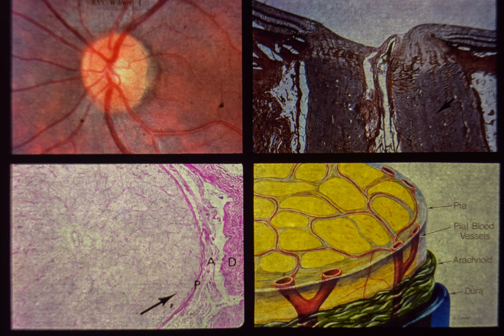The normal peripapillary retinal nerve fiber layer appears slightly opaque, with a radially oriented, finely striated pattern of superficial light reflexes. Opacity of the layer is greatest where the arcuate bundles enter the disc superiorly and inferiorly, since more fibers enter the disc in these areas.